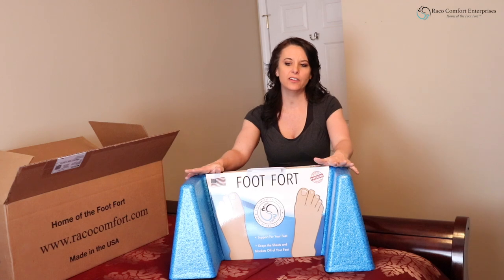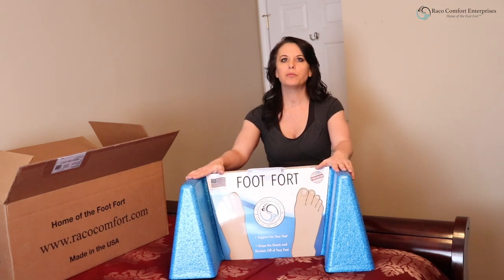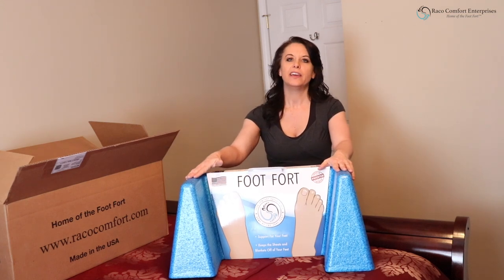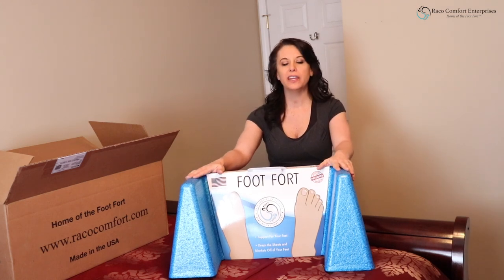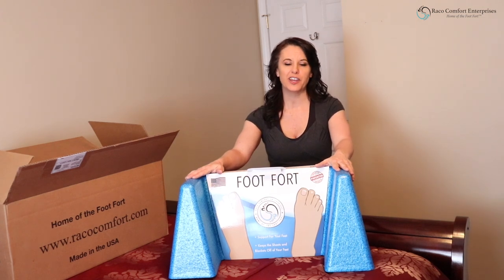For those that might have had surgery and have to sleep on their back when they're not used to that, it helps you to be really comfortable sleeping on your back. On the medical side, it's helpful for people that have toe ulcers, gout, complex regional pain syndrome, diabetic neuropathy, arthritis, and the main reason it was created — plantar fasciitis.